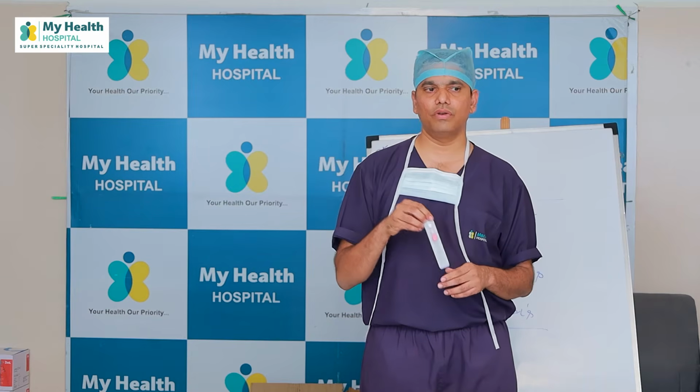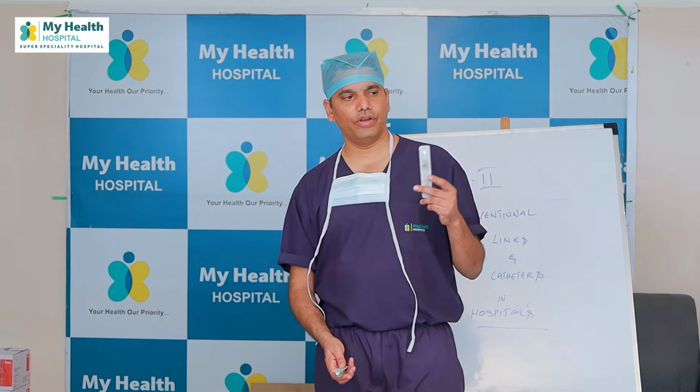So we'll keep it aside. It is most approachable, easily approachable. We'll do that. Okay. So what commonly used size is here? Which is it? Pink. So regular. Where do we use this one? When we need to infuse a large volume of fluid, we use this. Okay.